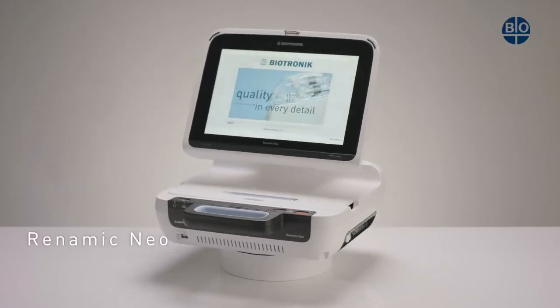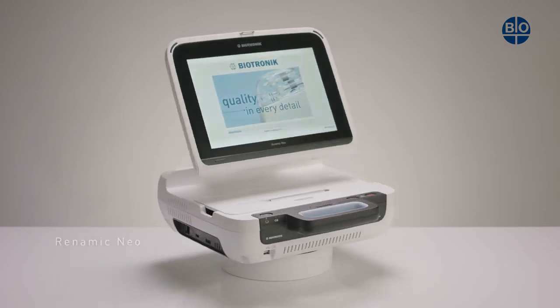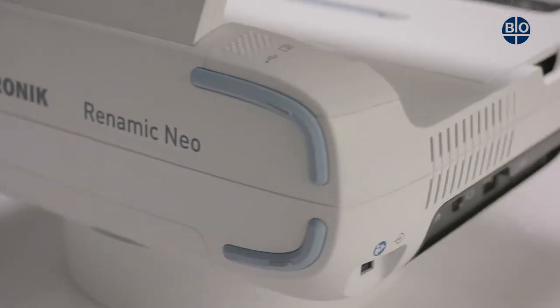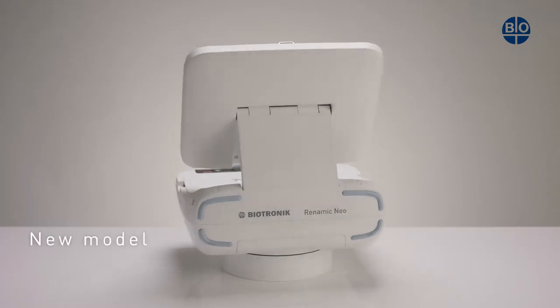The Renamic Neo is BIOTRONIK's latest device for patients who have active cardiac implants. The Renamic Neo replaces our previous Renamic programmer. But what is new and how does it work?